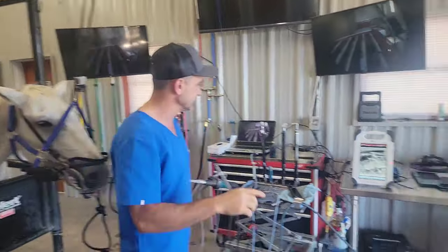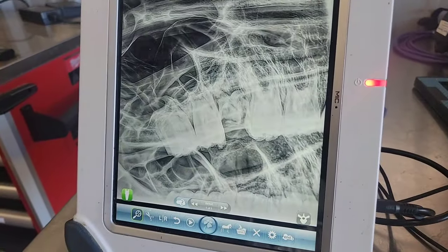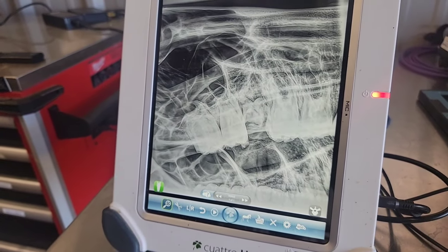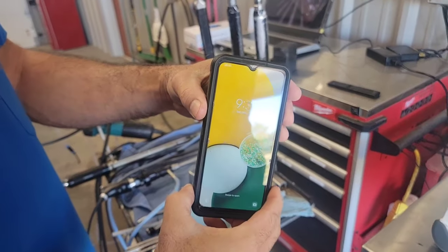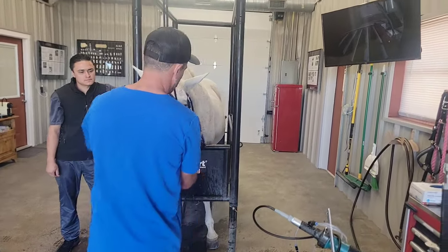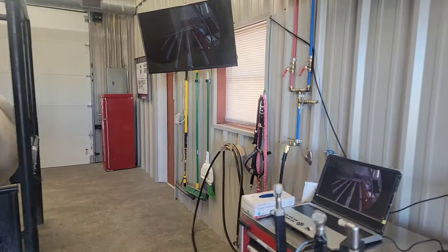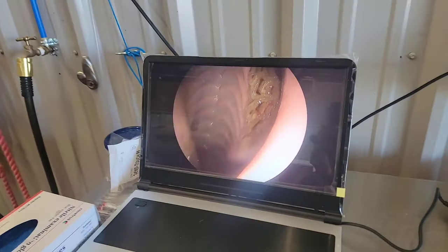With the means we have now, it can be so efficient. We'll show you what the tooth looks like, and in just a second we'll show you with the endoscope. The horse has been sedated in the stocks for about 10 minutes. The time right now is 9:36 a.m. We've already done the nerve block — so in 10 minutes we did the nerve block and got the radiograph. There's no clinical crown, which can make teeth definitely challenging to extract.